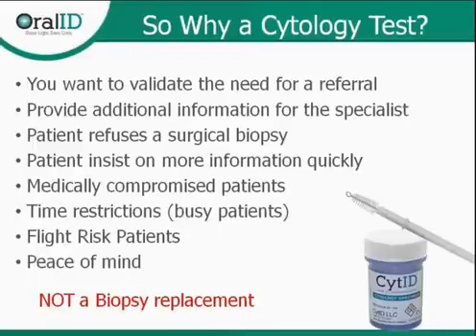Indications for use with your cytology would be to validate the need for referral or to provide your specialist with additional information. I have had stories told to me where a general practice had sent a patient to the specialist because of something they had seen with their light, something dark, but it wasn't something you could see in the white light exam. And so when it got to the specialist, they said, well, I'm not real comfortable cutting on something I can't see, so we'll just keep an eye on it. But think about that for a second. If they don't have fluorescence in their practice, what are they keeping an eye on? There's nothing to keep an eye on.